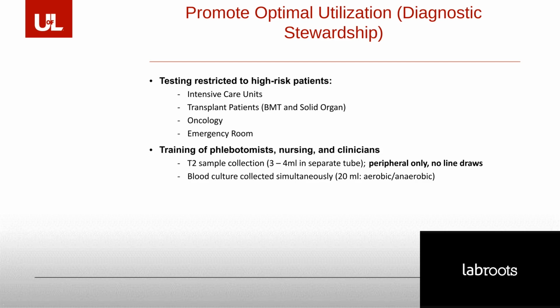Also, the training of phlebotomists is very critical, and I'll say more about that in a few moments. In situations where nursing is drawing blood cultures, they have to be trained, and even the clinician should be aware, not necessarily draw, but sometimes the clinician does have to draw a blood specimen for culture, and maybe in this case T2.